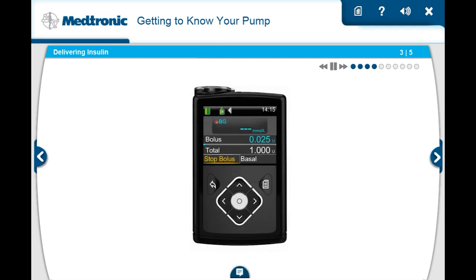The pump is the core of the delivery system. The pump can deliver insulin in very precise amounts, as small as 0.025 units.